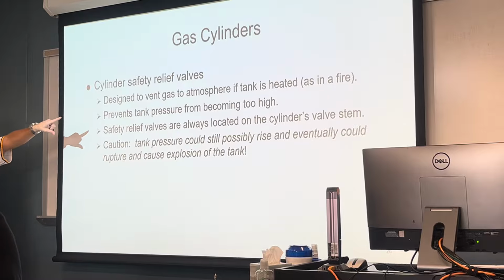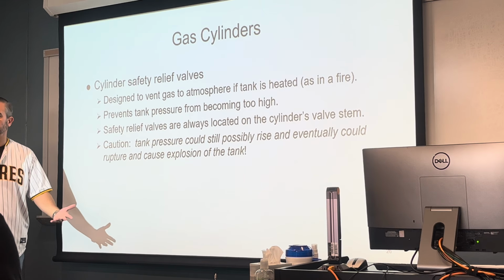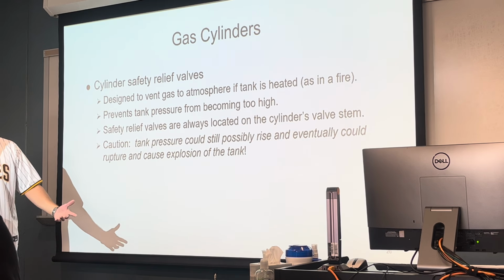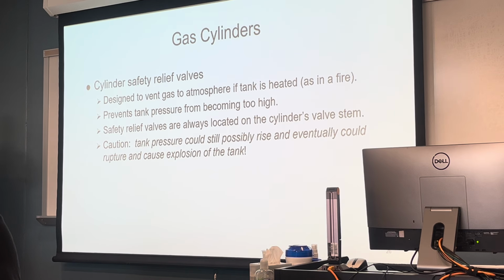Now, what's going to cause it to heat up? What if it was in a fire? You know, what if a tank was in a fire? Again, we don't want it to explode and cause that additional damage or injury to anybody by the tank exploding. So that's why the safety relief valves are there.